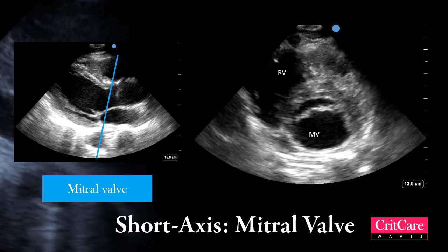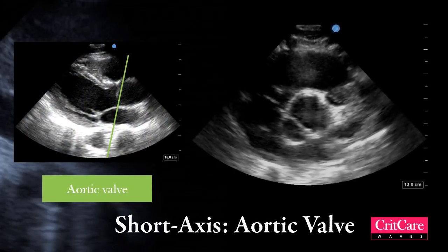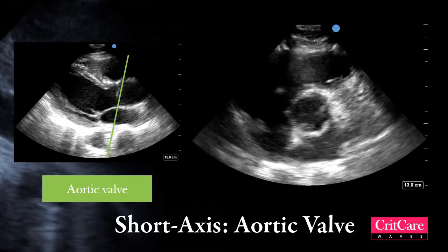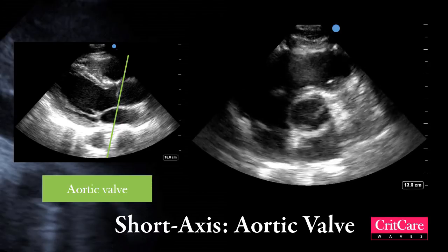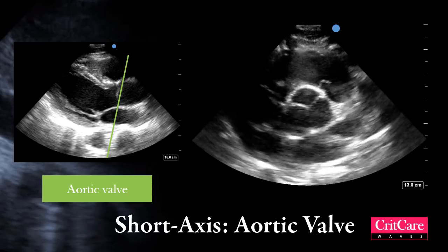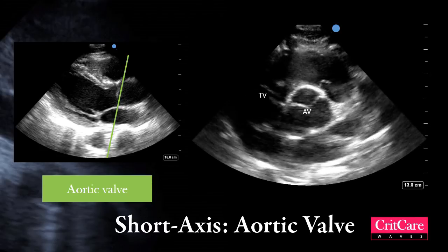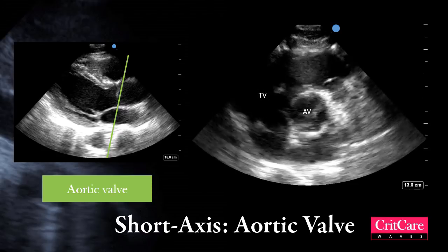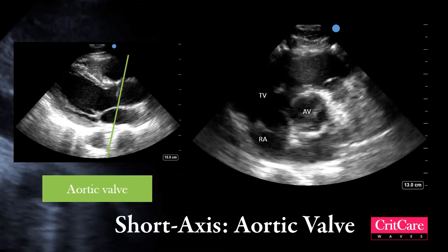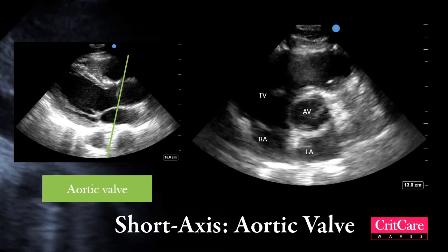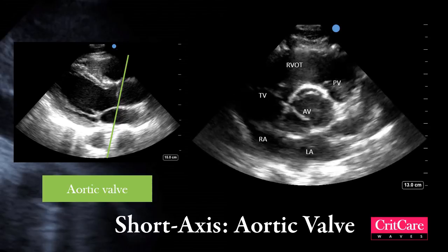The next view is obtained by further fanning of the probe. This is at the level of the aortic valve, which shows a circular shadow in the center with its three leaflets. The tricuspid valve is adjacent to the aortic valve, and the right atrium is seen next to the tricuspid valve. The left atrium is adjacent to the right atrium. The pulmonic valve and the right ventricular outflow tract are seen in the near field.